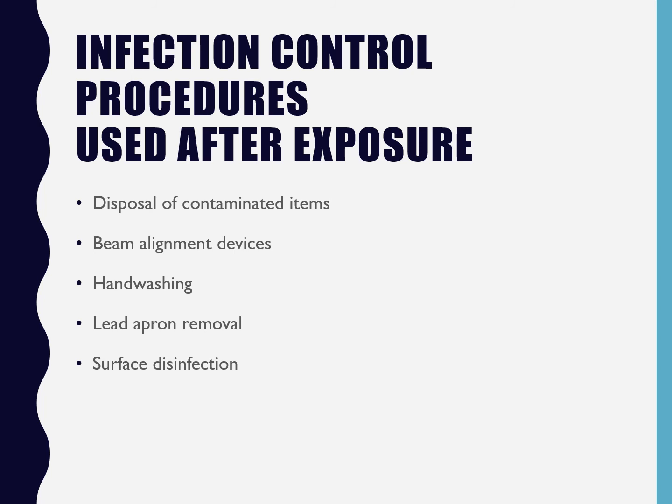So you'll be either using cavi wipes or you'll be using the spray wipe spray method. With spray wipe spray, it's important to spray first, wipe all of that down. That gets all of the blood, saliva, debris off of all of the surfaces. And then you spray again and you let it dry. You want to very lightly spray, right? You're not going to soak all of the items. But you do lightly spray so that the disinfectant remains on the surface for long enough that it truly does disinfect and it does what it's supposed to do by killing tuberculosis and things like that.